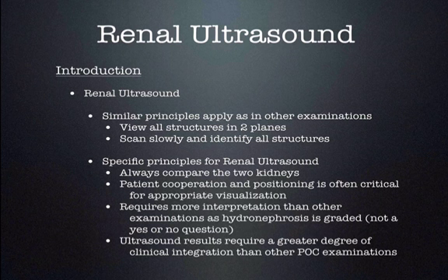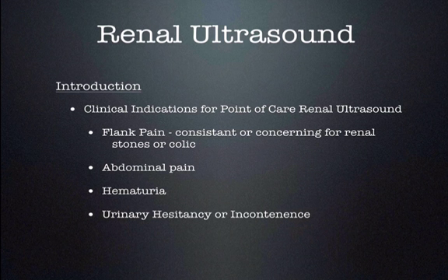Scanning patients with hydronephrosis or pyelonephritis can be very uncomfortable and or painful, so pre-treat with pain medication to allow for maximum patient cooperation. The clinical indications for point-of-care ultrasound are broad and include any patient with flank pain, abdominal pain, hematuria, or any urinary complaint.